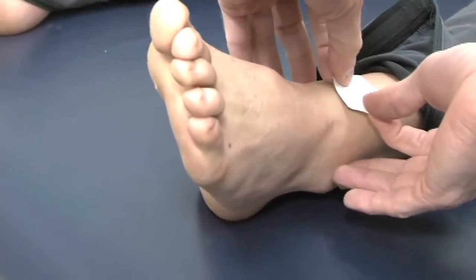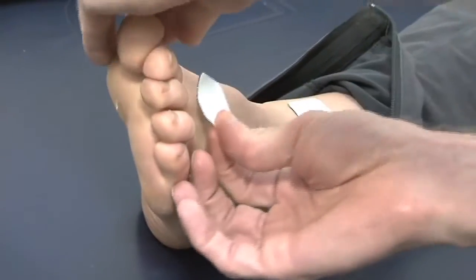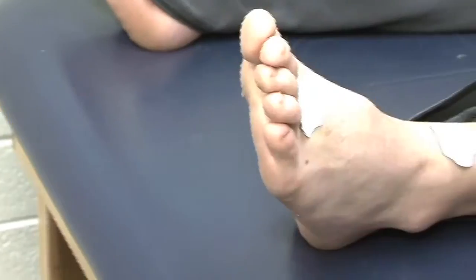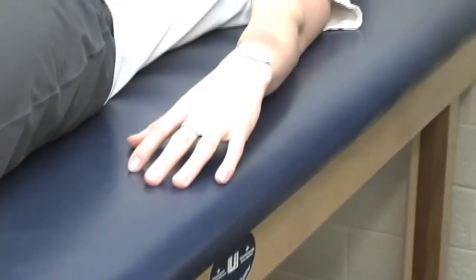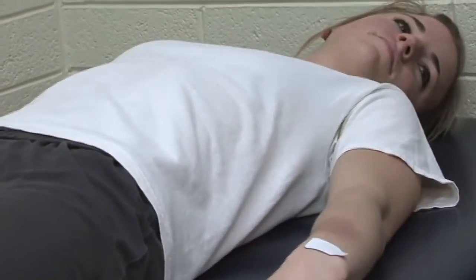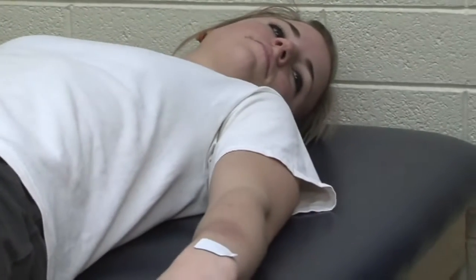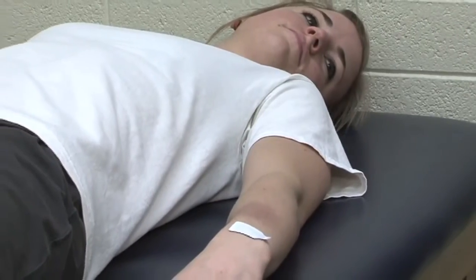Down here, I'm going to bisect the malleoli, and then we put this one down at the base of the toes. The client positioning is very important. This method assumes that we're a series of cylinders — one cylinder for each leg, one cylinder for each arm, and a cylinder for the trunk. So it's important to keep those cylinders separate; you don't want to have the client with any body parts touching.